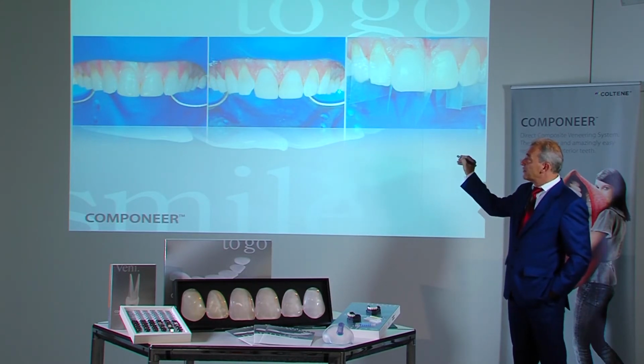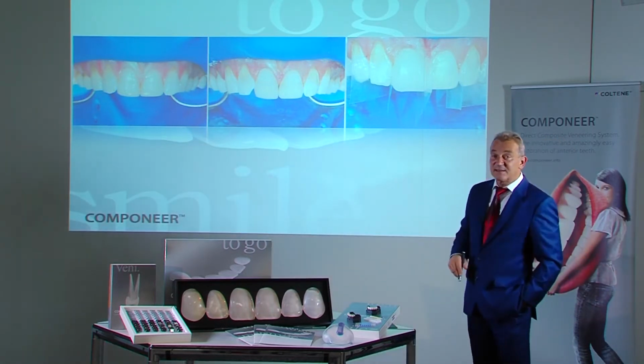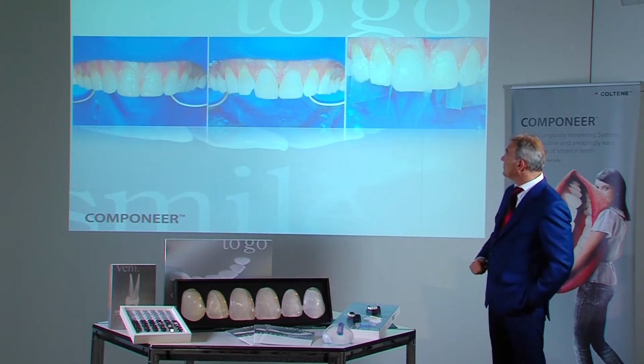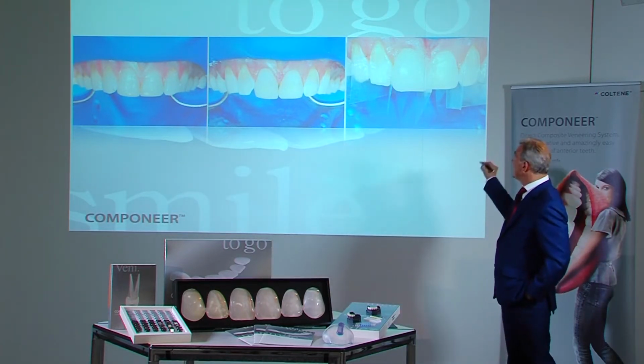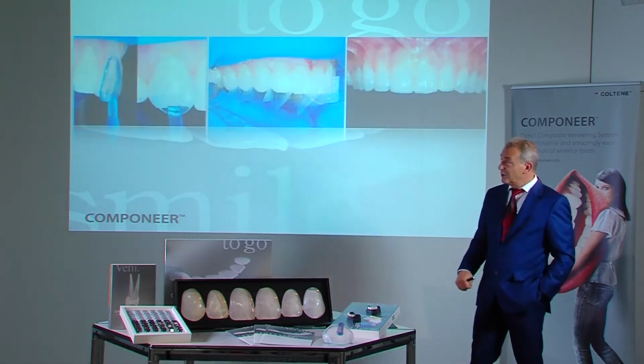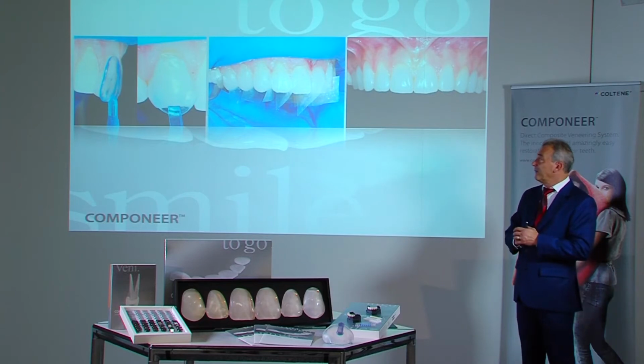Here again you can see the frost-white appearance of the enamel as a result of etching. The exposed dentine areas were, of course, blanked out for etching. The first Componeer was placed in the correct position. It always pays to take sufficient time with the first Componeer, as this serves as marker. Once the first Componeer has been placed properly, then the others are easy to place.